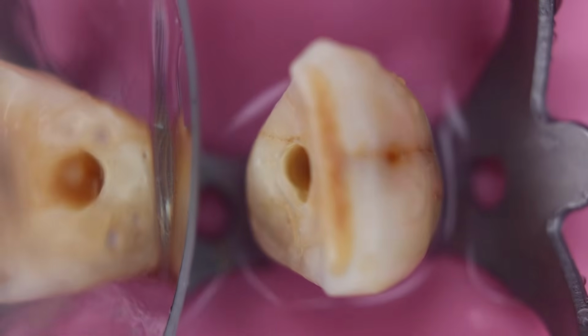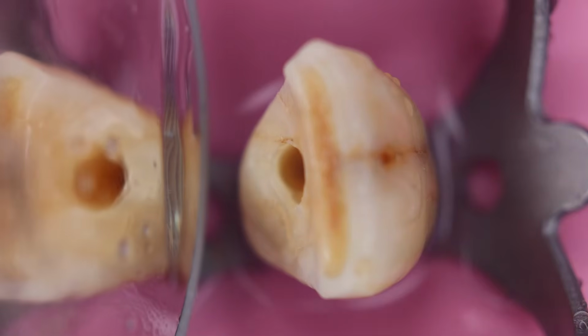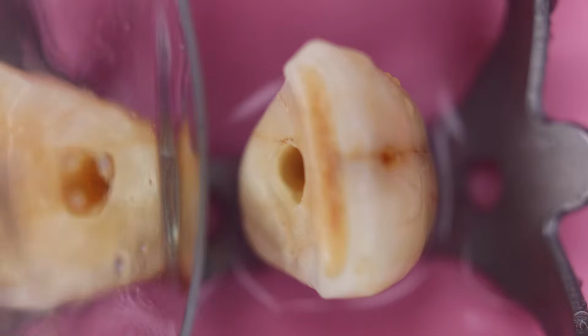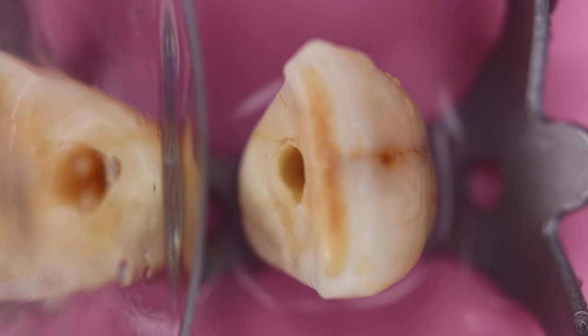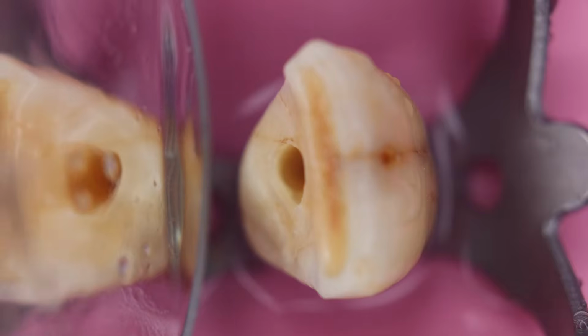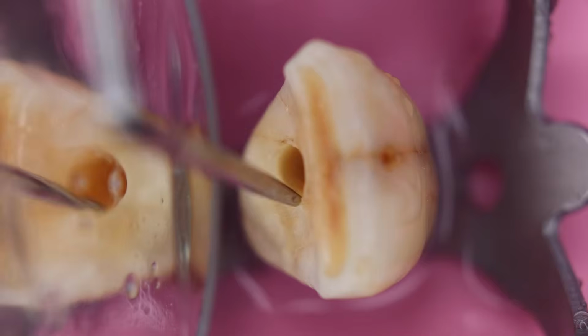So this is the time you have gained the access into the central incisor root, but you need to shape the access cavity so that the file doesn't hinder in between these walls.